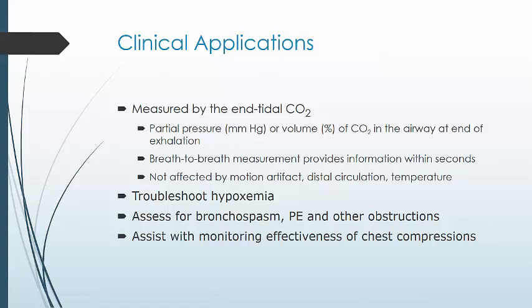For hypercapnia, you're looking at ventilatory failure. The whole purpose of ventilation is to bring in oxygen and get rid of excess CO2 in the body. So if we are not ventilating properly, then we're going to retain CO2. In some end-stage COPD patients, they may retain CO2, and it increases slowly and slowly.